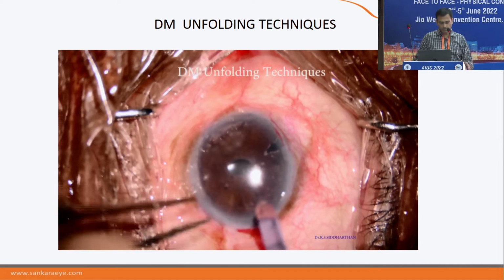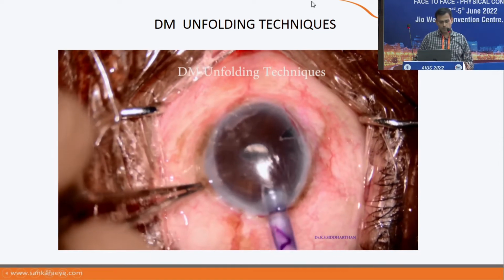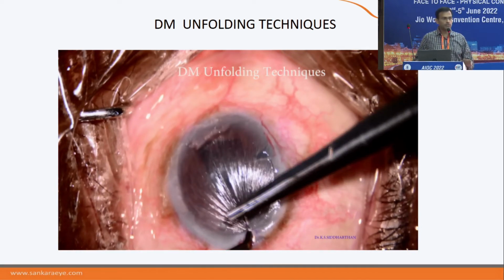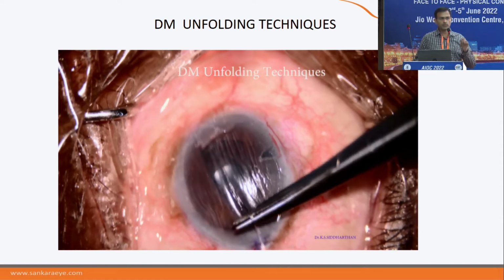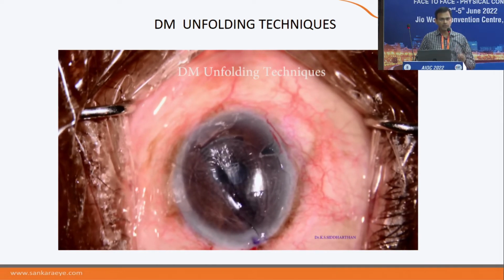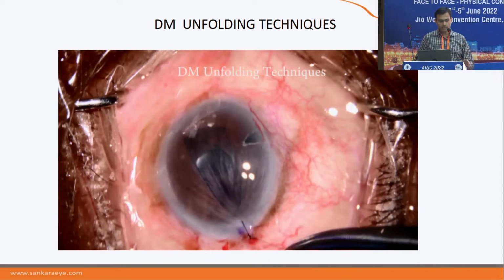Here are a few of the techniques, as Vikas was showing you. I'll be showing them here. Initially we used to tap. But before you do any of these procedures, put a suture. If it's going to be a 3.2 or whatever size, apply a suture before you manipulate the tissue, because the tissue is so small and so thin, it will come out very easily.